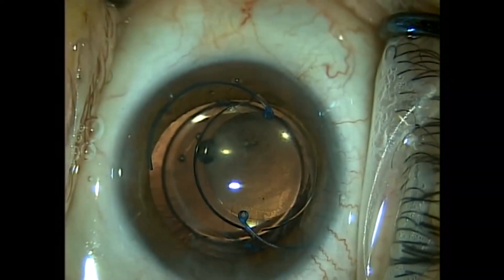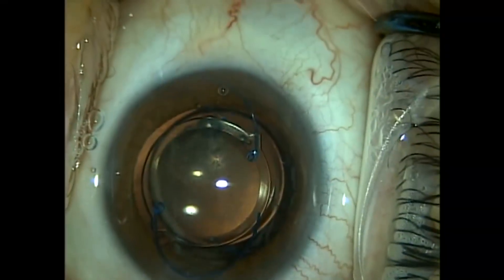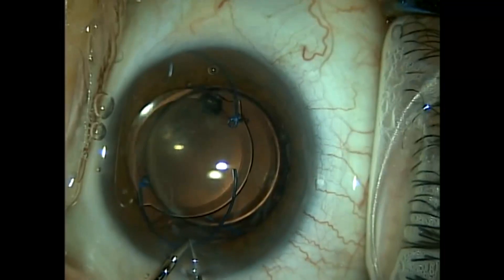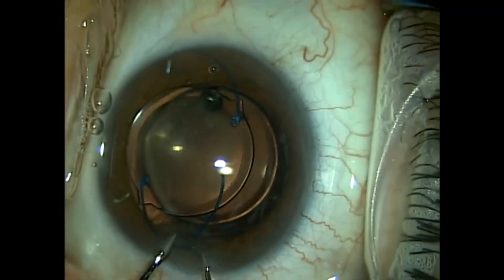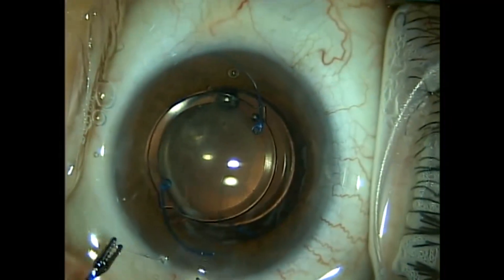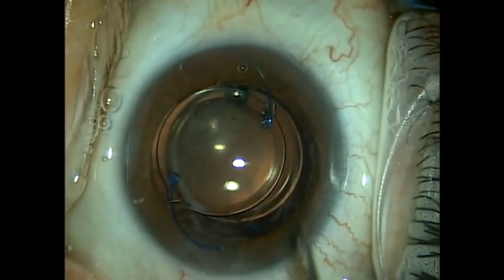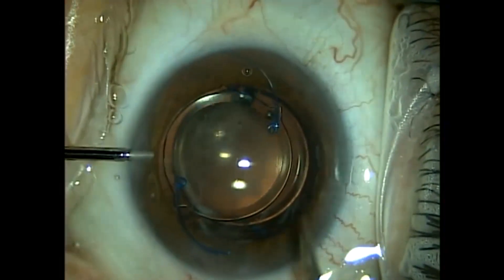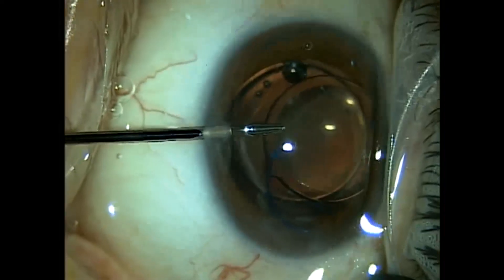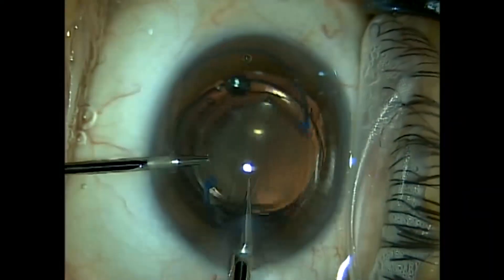You have capture of the optic under that anterior capsule leaflet, which aids in centration, keeps the vitreous back, and is also going to preserve a more normal refraction for this patient. We then use special instruments made by MST Microsurgical — I just trim one of the haptics. Then I use a serrated forcep introduced through the paracentesis port to stabilize the lens, cut the lens in half up to the center, rotate the lens 180 degrees, and cut the other half.